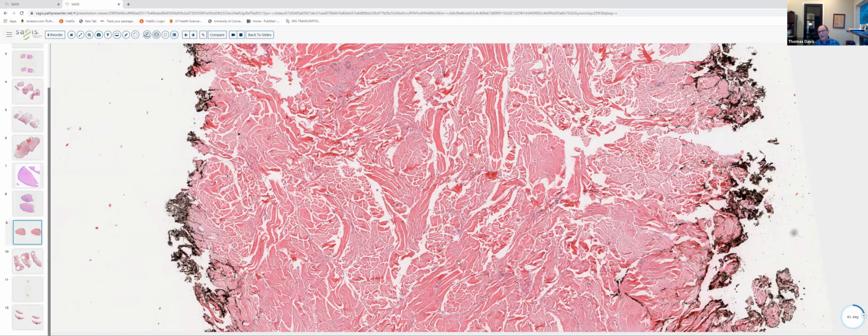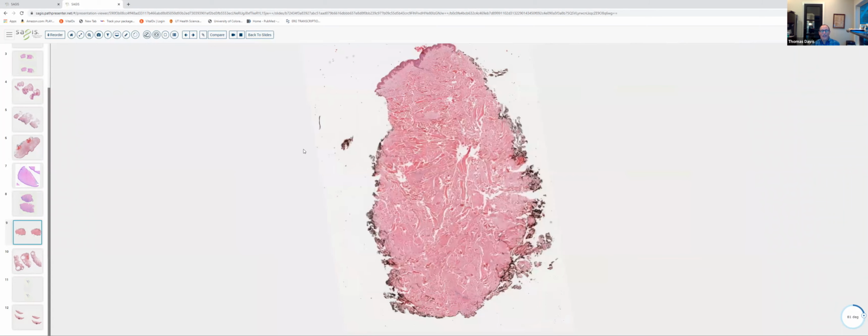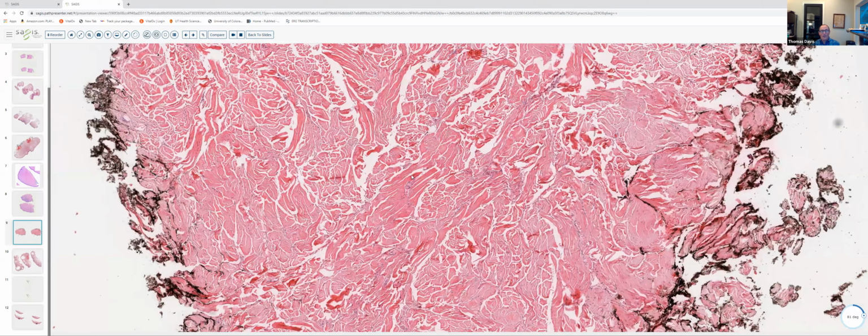So we really kind of have to have clinical pathologic correlation to make the diagnosis with absolute certainty. A lot of times if we see this type of change, we'll suggest a connective tissue abnormality such as a collagenoma, but it's nice to be able to correlate that finding. So subtle change, and again, clinical pathologic correlation is required. But what you want to look for are thickened collagen bundles that aren't necessarily sclerotic. There's no fibrosis, no inflammation.